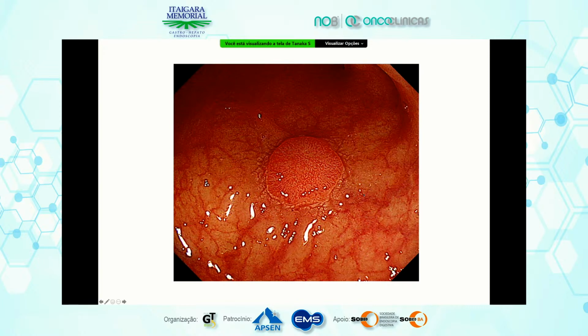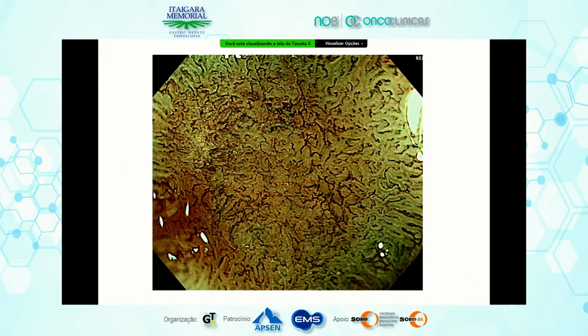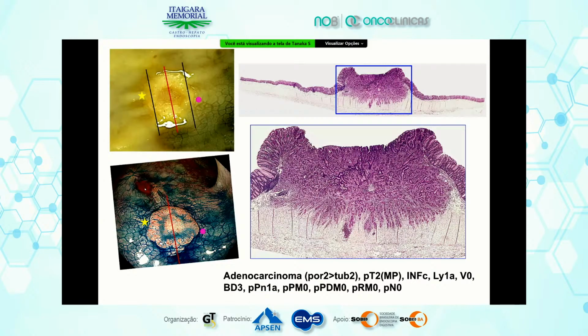So at this point, we suspected this region is MP cancer, T2 cancer. So we sent this patient to surgery. This region shows invasion into the muscular layer.